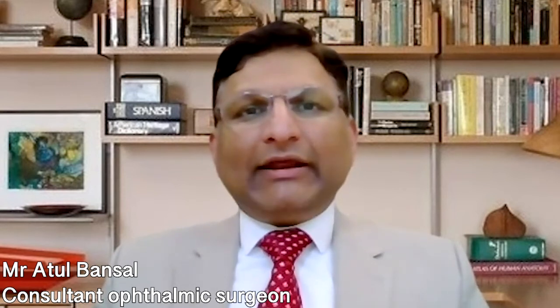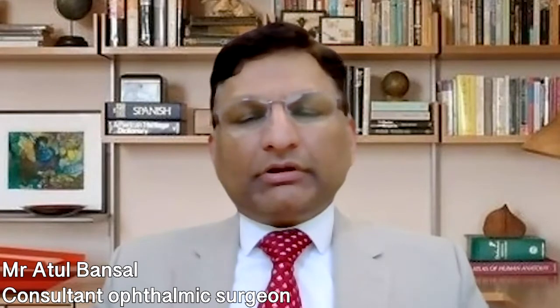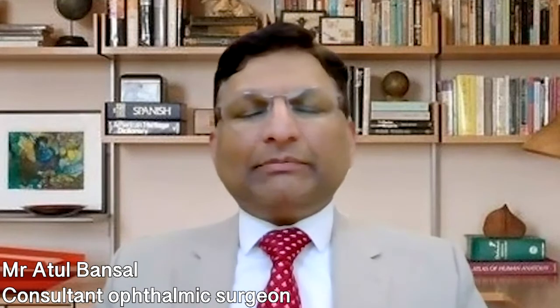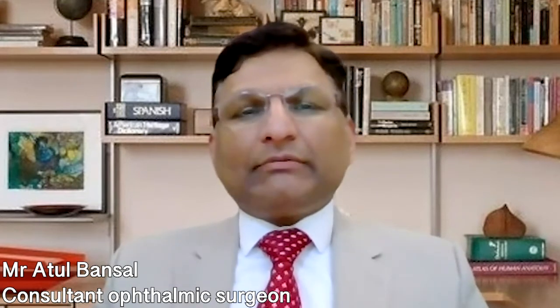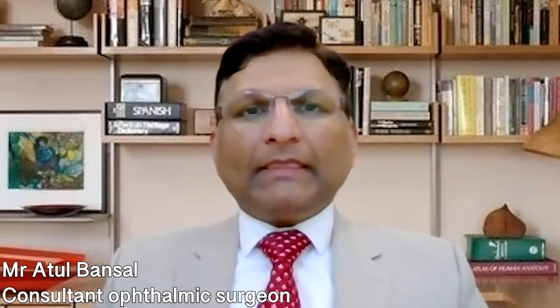Similarly, YAG laser iridotomy is done in an outpatient setting with just numbing drops on the eye, and patients are quite comfortable. They might feel a little bit in this type of laser, but most of them don't call it pain. They might have a slight discomfort for a few seconds, which settles down very quickly.